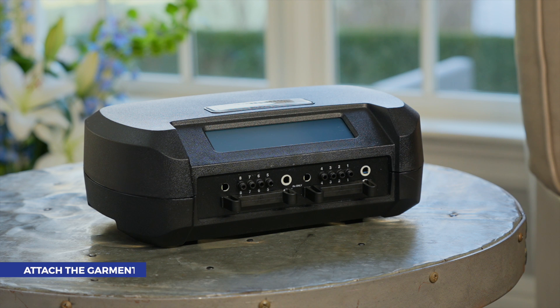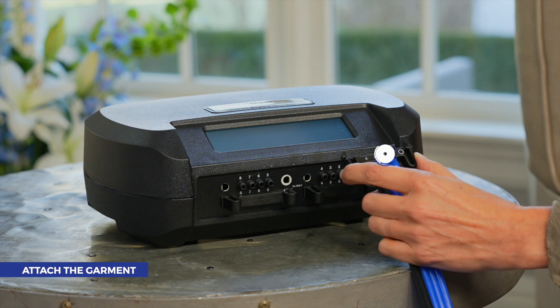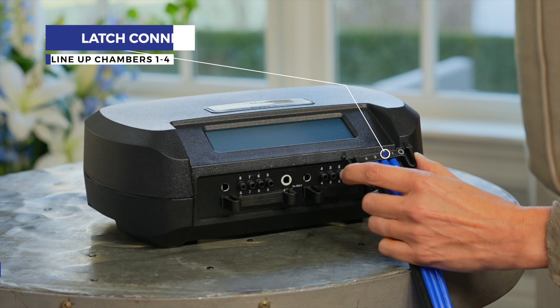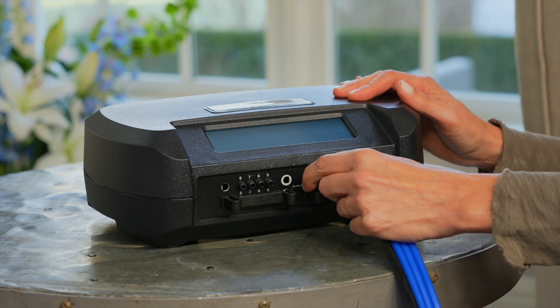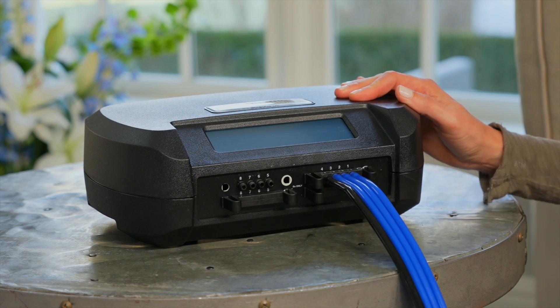Now it's time to attach the garments. The Quick Connect System makes it easy to connect tubes from your garments to the pump. Line up the chamber numbers one through four on the latch connector with the corresponding numbers on the pump. With the numbers facing up, squeeze the clip and insert into the port. It's that easy.